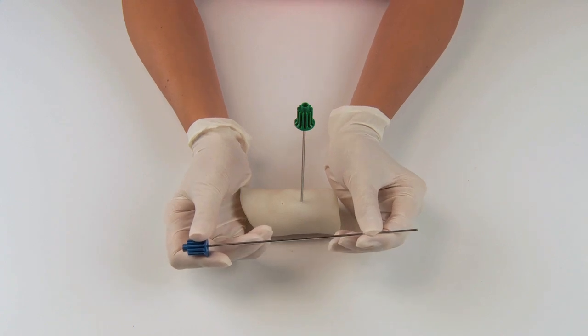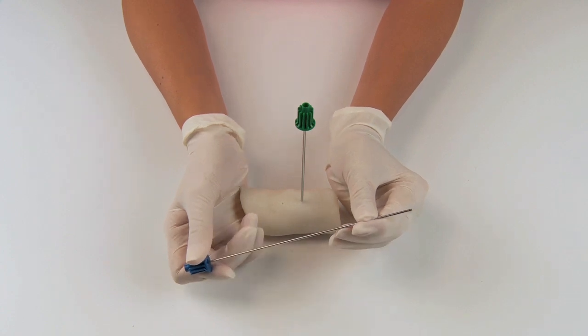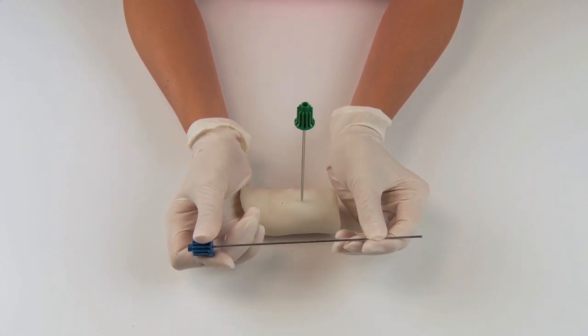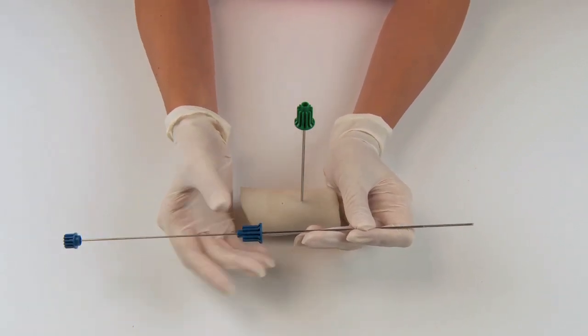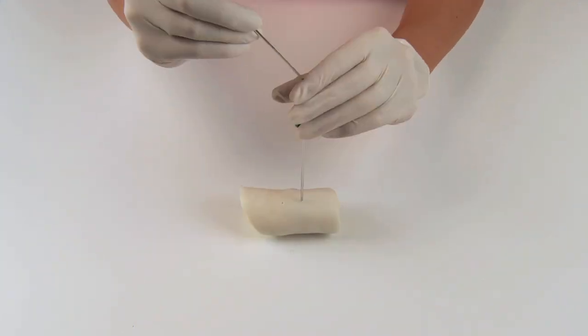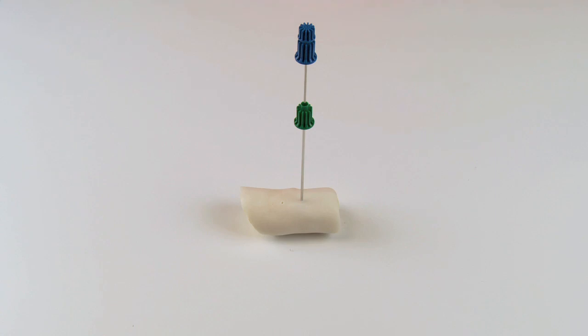It is important to note that the blue cap biopsy cannula is shaped like a cone. Therefore, the sample is pushed out through the lower opening of the cannula hub in order to avoid crushed artifacts. When performing multiple sampling, the stylet should remain in the biopsy needle until the new sampling location is reached in order to avoid contamination of the following samples.